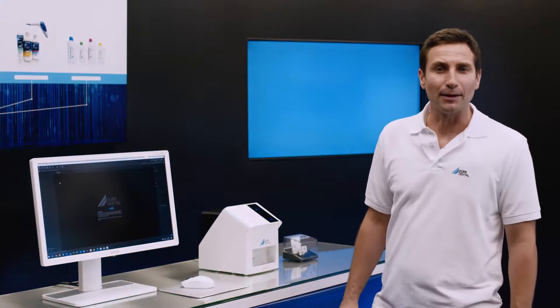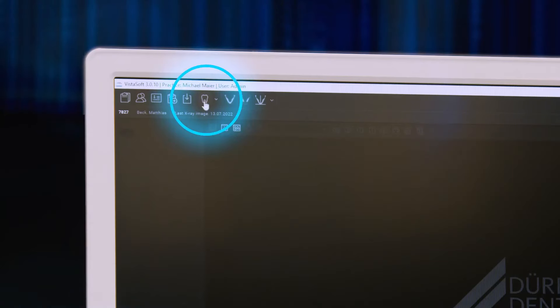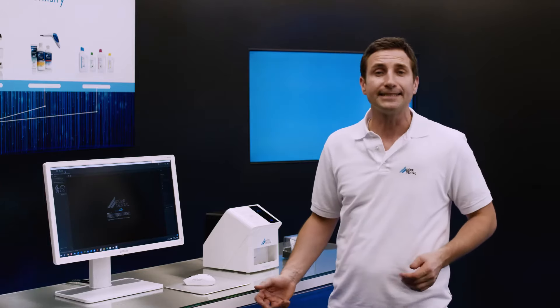The VistaScan MiniEasy 2.0 is connected to the practice's network via LAN, and so it's available to every PC in the network. Just one click in VistaSoft is all it takes to establish a connection to the device and start a scanning task.